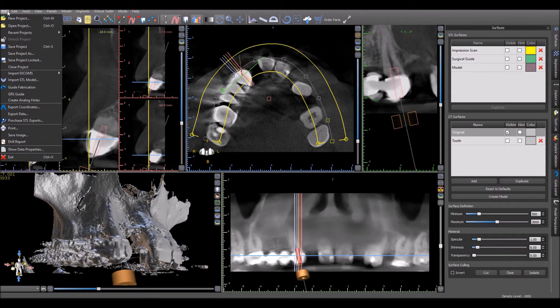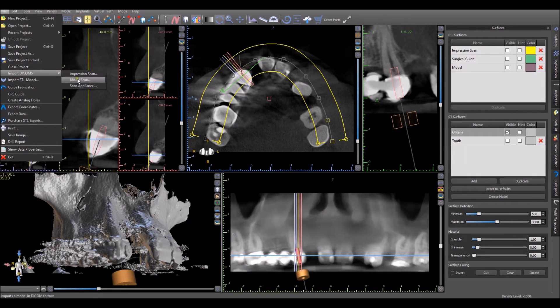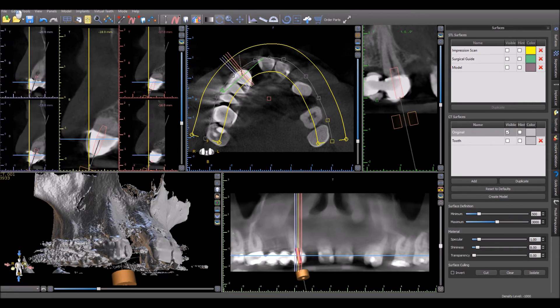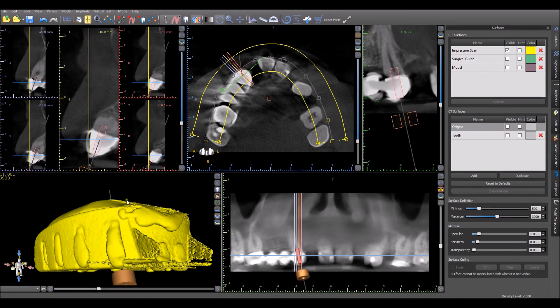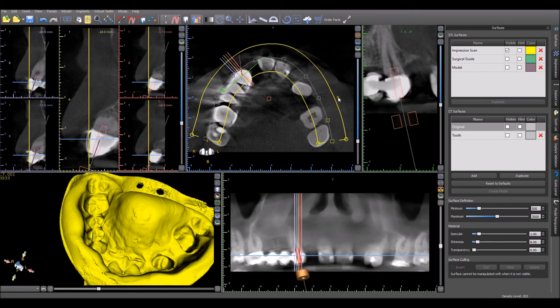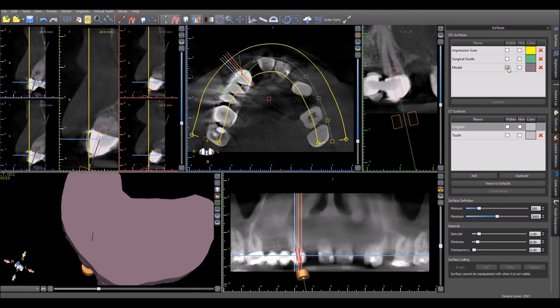Import a model by going to file, import DICOMs, and choosing to either import an impression scan — which will invert directly in Blue Sky Plan — a model scan, or use import STL model to import an STL model. In this case, I imported the impression scan and inverted it directly in Blue Sky Plan to create a model.